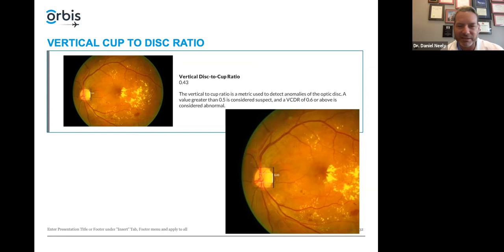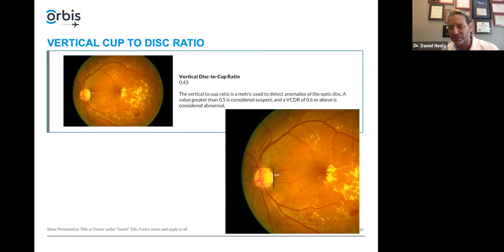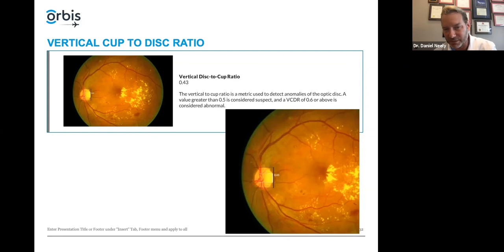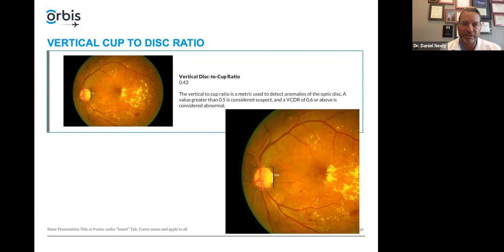I think this is a really cool feature because I expect it's going to be consistent over time. This is like a poor man's OCT — a nice way to follow your patients over time, because you now have a more precise estimate of the cup-to-disc ratio than I could do clinically. I might write down it's a 0.4 or a 0.6, but this breaks it down into hundredths. So you'll be able to follow this patient over time with multiple AI analyses. If it was 0.43 in June 2019 and a year from now it's 0.48 or 0.5, you'll want to look at that patient carefully — maybe that cup has truly progressed. If the cup-to-disc ratio is more than 0.6, it definitely gets flagged.